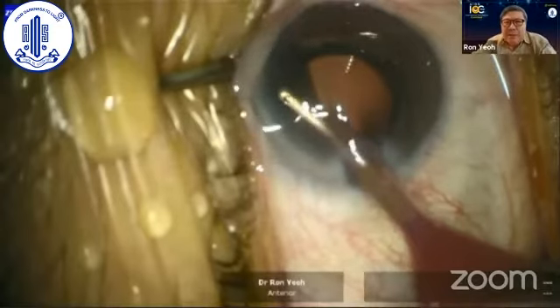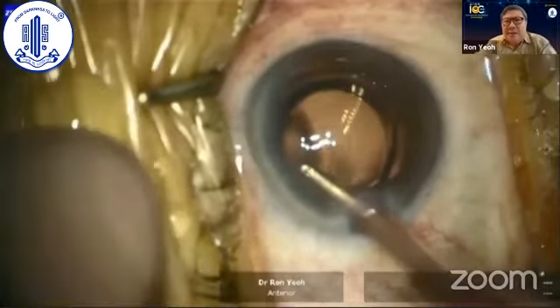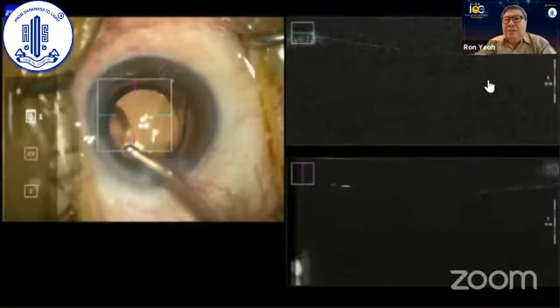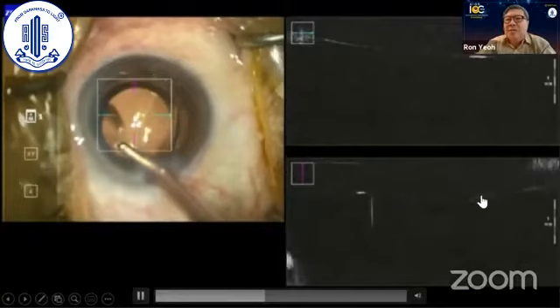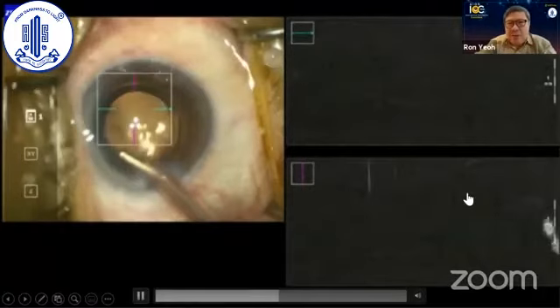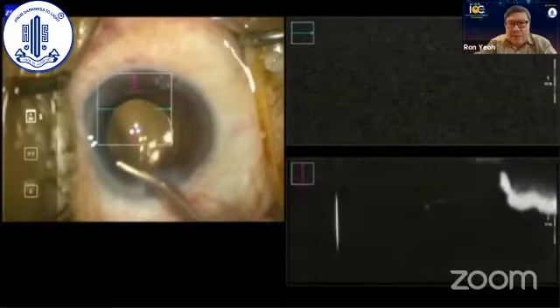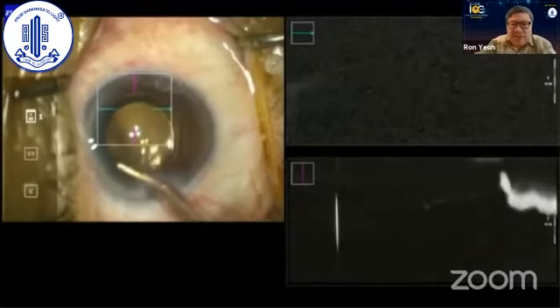So looking at that, I put the lens in, and I'm just turning on the OCT now. Now, this one's a lot more subtle than the previous case. Where you look here, on the bottom right, you see there's that little scroll, that little curved edge. Now, using the OCT to image structures deep in the eye is sometimes challenging because of the focusing required and so on and so forth.